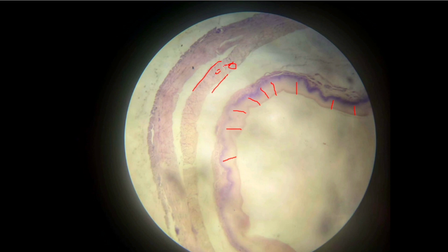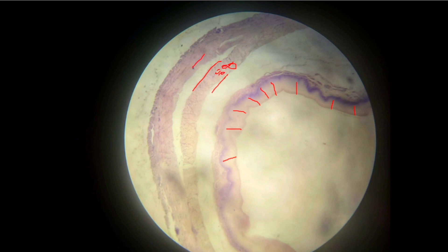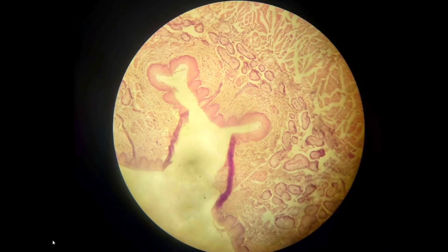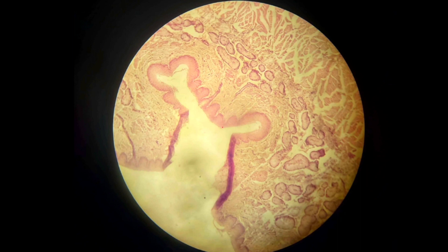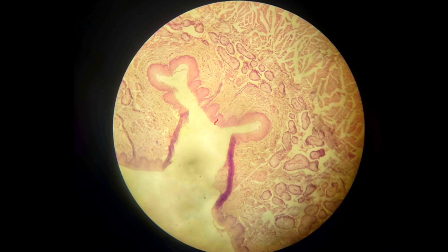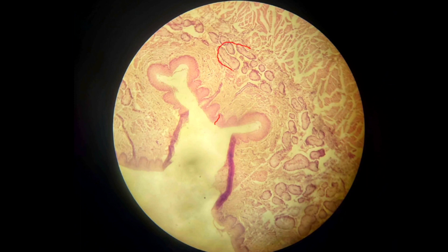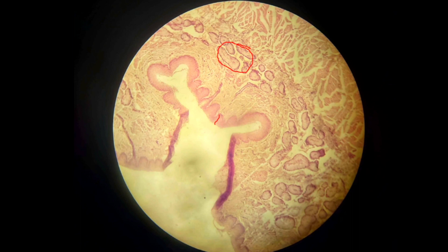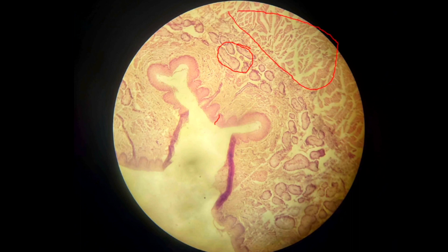These are the esophageal glands — submucosal glands. And these are the muscle layer. This is also a slide of esophagus. This is another esophageal slide. Here is the lining, and this is the submucosal gland. This layer is the muscle layer, that is right?